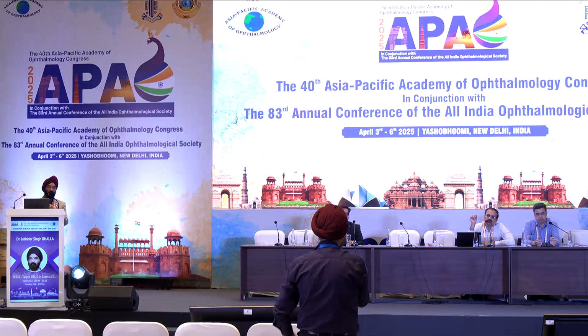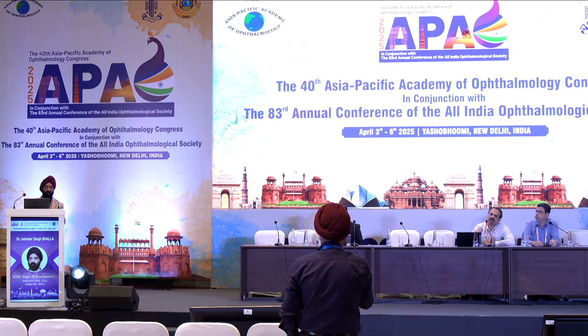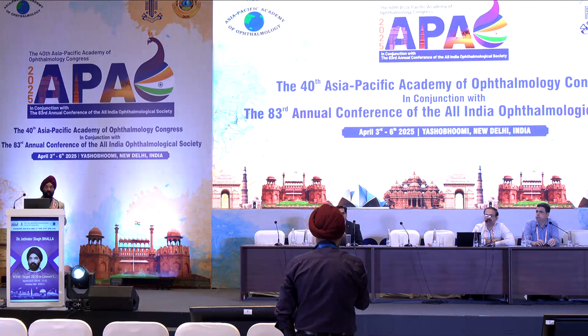Suppose there is a big difference between immersion and IOL Master. Should we go for the IOL Master? Again, I'll go with Piyush. A large error should not be there. A small error is understandable. Then we have to optimize our equipment. We have to calibrate. A large error should not be there. Thank you.